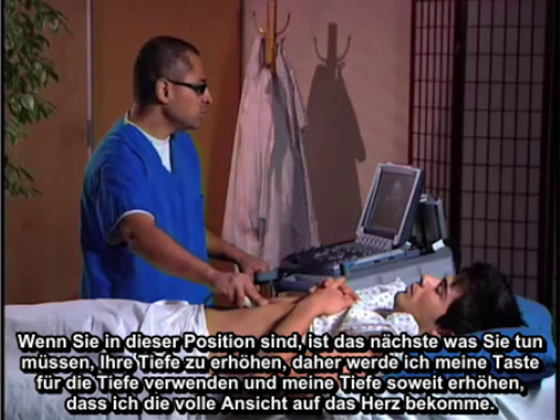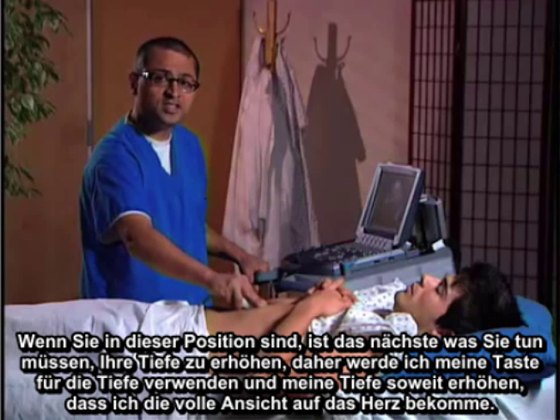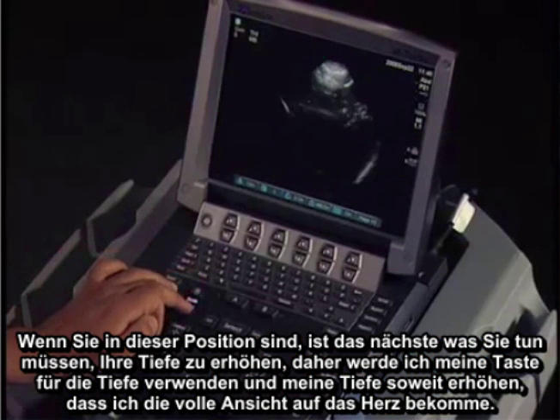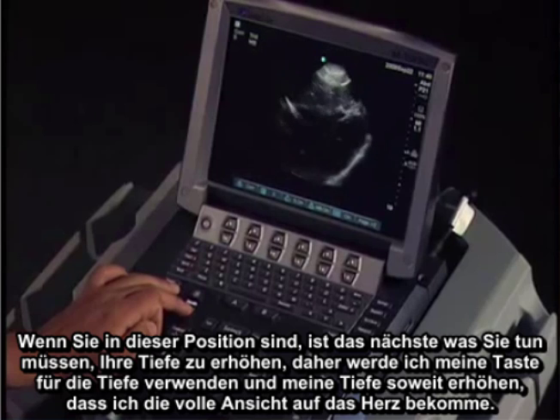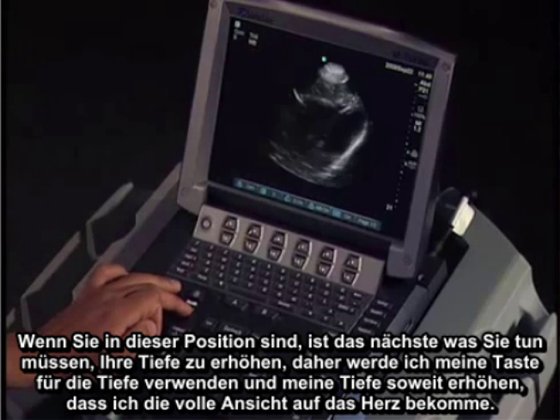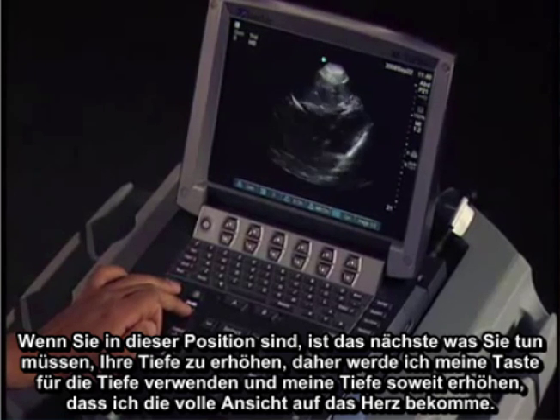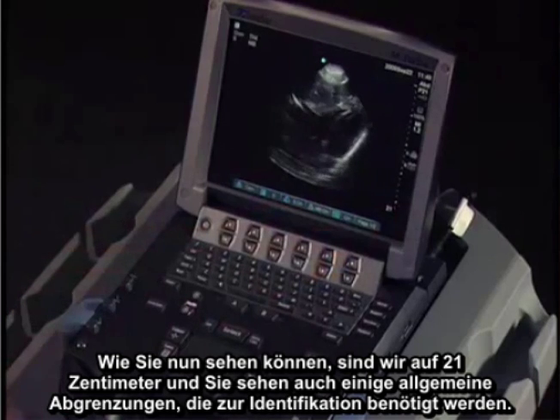When you're in this location, the other thing you're going to need to do is increase your depth. I'm going to use the depth key right here and increase it so I can see the full heart in view. Now you can see we're at 21 centimeters.